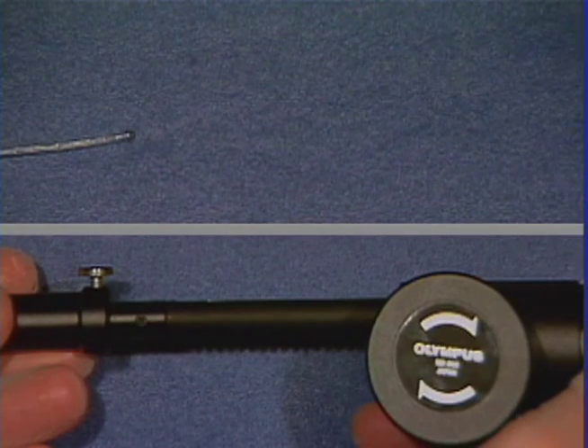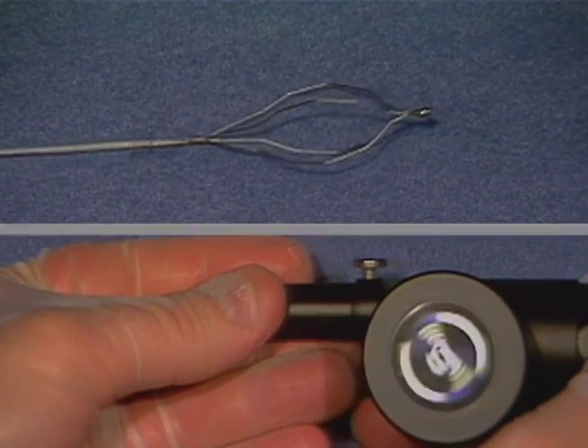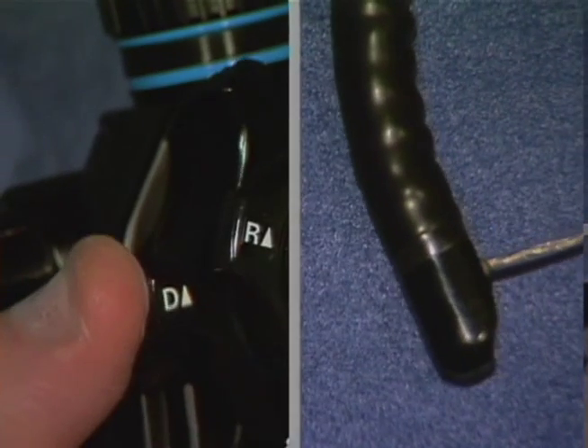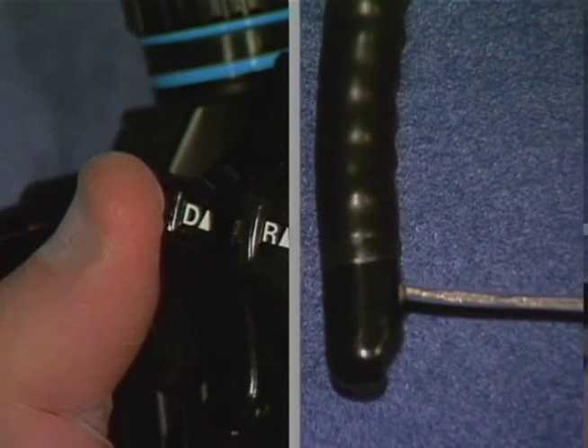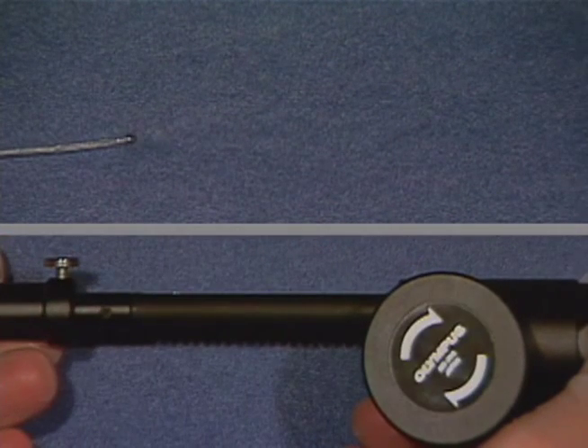Grasp the calculus by opening and closing the basket. If the opening or closing movement of the basket is difficult, do not apply excessive force. Instead, relax the distal end of the endoscope until the basket can be moved with ease. The opening and closing movement of the basket is controlled by pushing or pulling the holder of the BML handle.